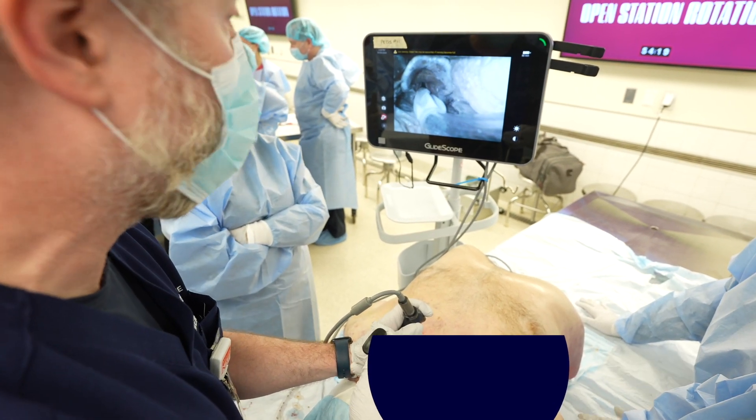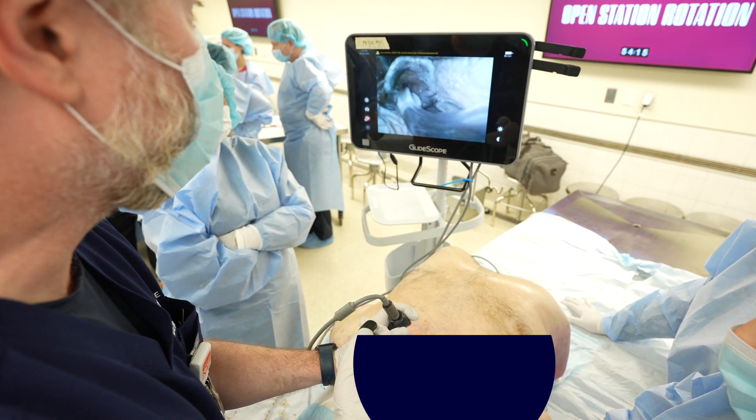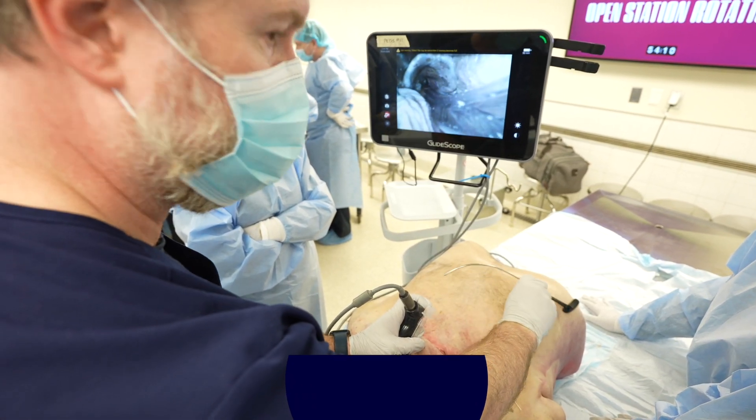You can do this a couple of times — it's just one, two, three and it goes right in. Then I grab here, flip, and out.